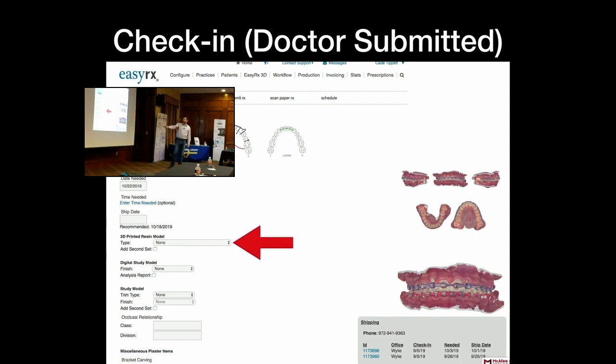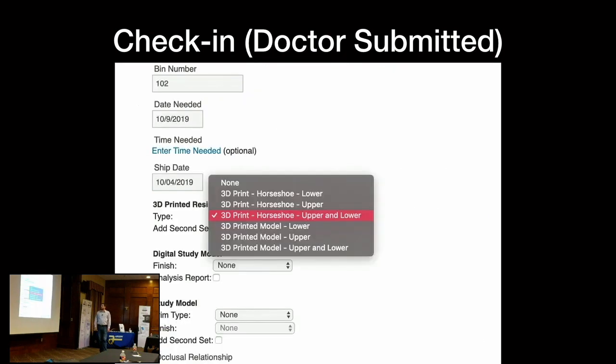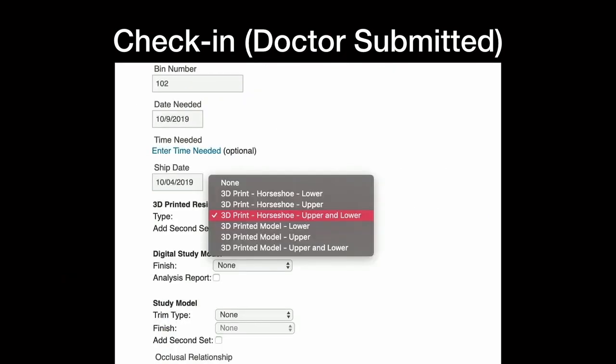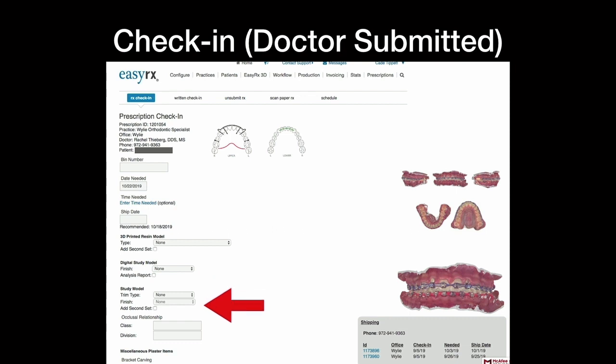So 3D printed models. Obviously we need to charge for printing, which is here. And you come up with these in your own. So I have two horseshoes, horseshoe upper and lower, two full pallet models, because with ortho you need the full pallet for RPEs and stuff like that. Usually the horseshoes are for Essex. And then of course you've got all these options. They can ask for digital study models, they can ask for study models. You see that bracket carving? I see they have brackets. I can say bracket carving upper, bracket carving lower, and it automatically charges their account. Not, it doesn't charge their account, bills them.